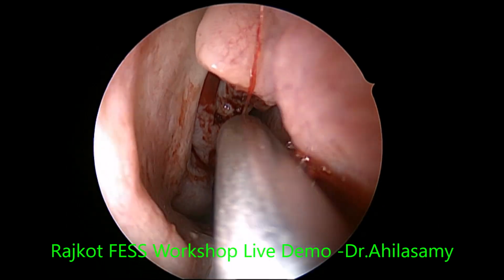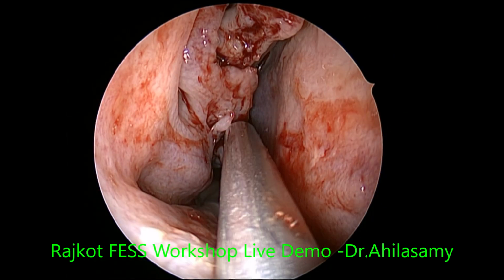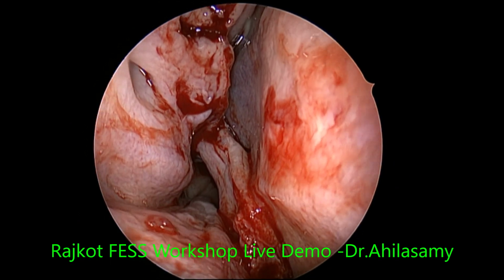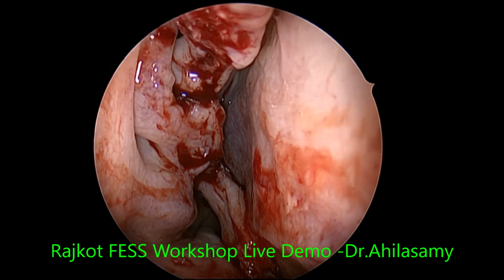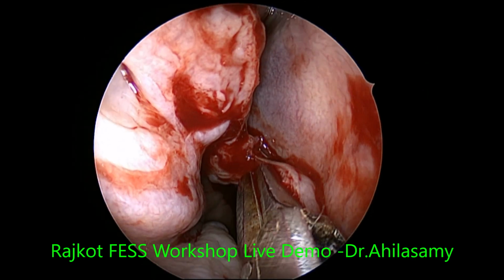See, hardly any bleeding under local anesthesia. Patient is also very cooperative. In fact, I am trimming the middle turbinate, still hardly any bleeding. Take care not to trim the whole turbinate. Keep a small attachment and just cut, don't avulse.